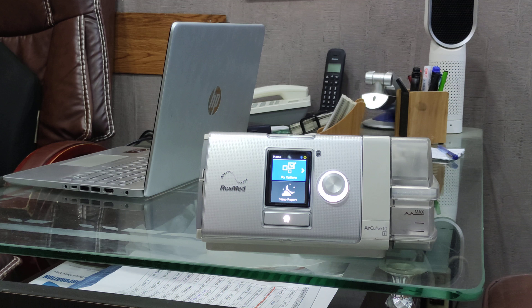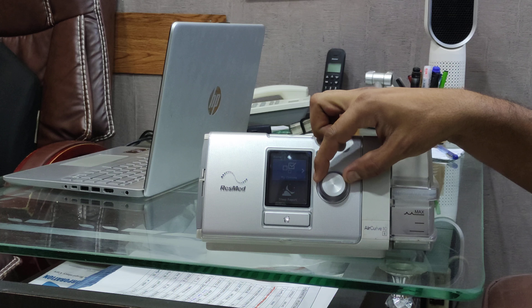Hello friends, welcome to Raza Corporation. Today we are going to show you the settings of the ResMed AirCurve 10 BiPAP device.